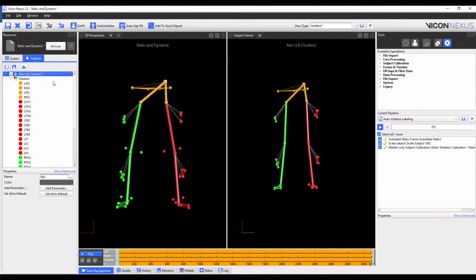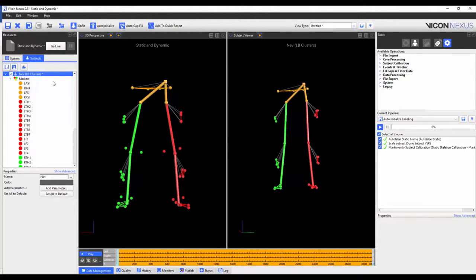Now that I have done a static calibration, I could either use this calibrated subject for auto labeling the dynamic trials, or I could perform a functional calibration to further optimize this subject. The decision as to which step to choose will likely depend on the quality of the original VST and how dynamic the movements are in the subsequent trials. This can usually be determined by performing a quick pilot test after creating your VST.